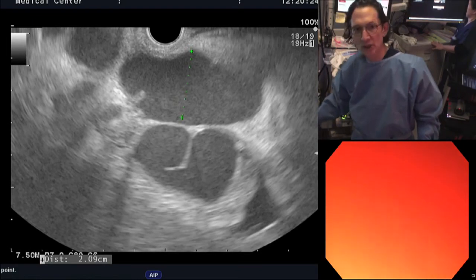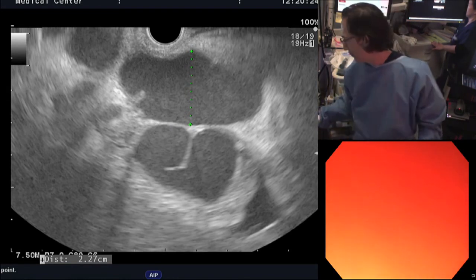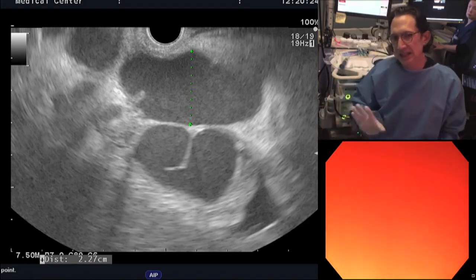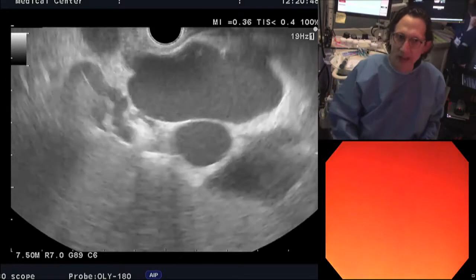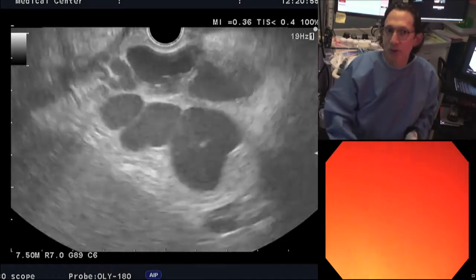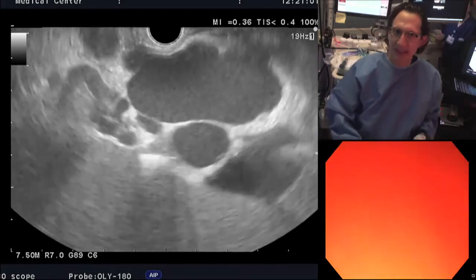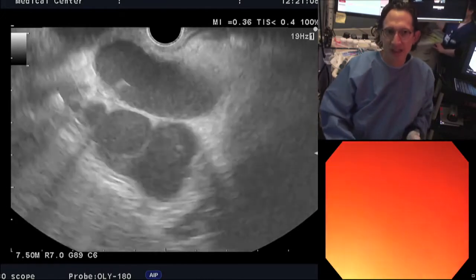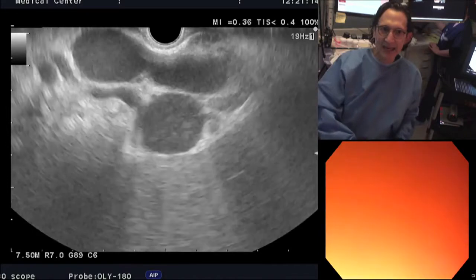Now, these are the gastrorenal shunts. We're not putting coils and glue into this. But look at these shunts. This is huge. This is 2.3. Now, this is not widely available in the U.S., but if I were consulted on this case and it were available, I would consider the option of BRTO. So this is the balloon retrograde obliteration done by the radiologists, because they can actually target these gastrorenal shunts quite nicely. I'm actually surprised, though, that the radiologists didn't really get their coils here, because I don't see the coils here, right? I mean, I will look for them.